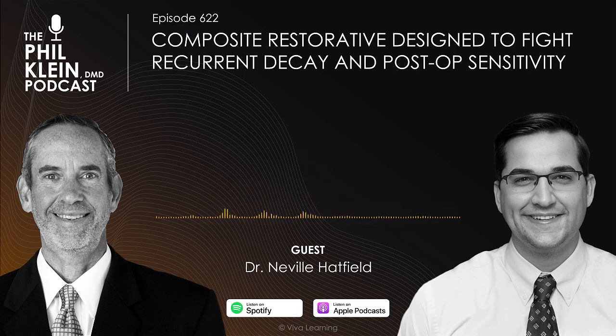I think the first thing is our bonding agent, because that's the first layer between the tooth, or in theory, one of the first layers between the tooth and your restoration. So a really important thing is the bonding agent, what kind of bonding agent you have, what generation, I guess you'd call it, that it belongs to, and what it can really do for you. So there's various different bonding agents out there.